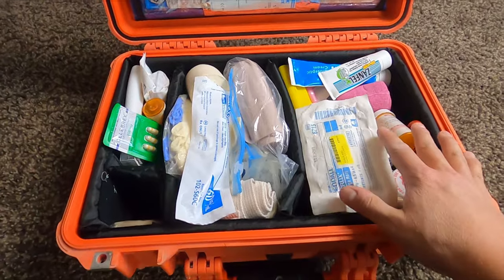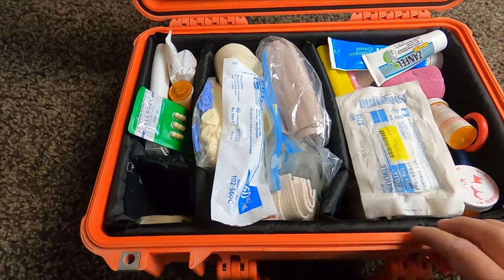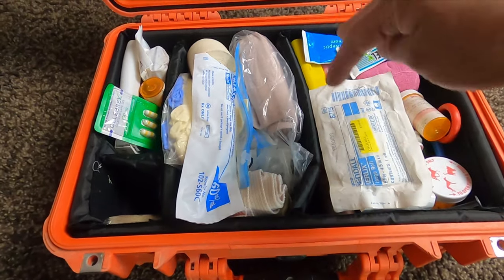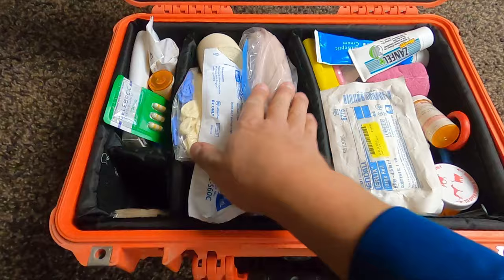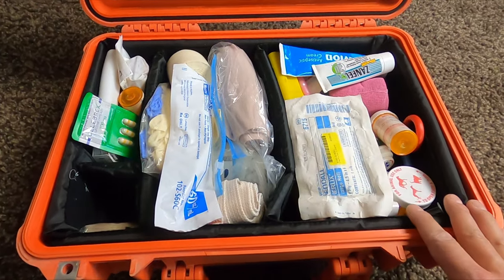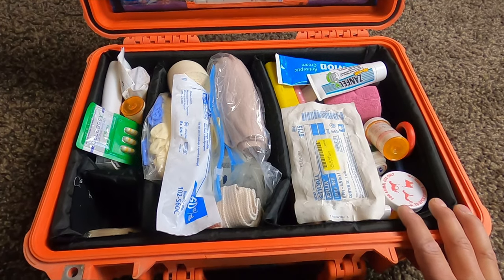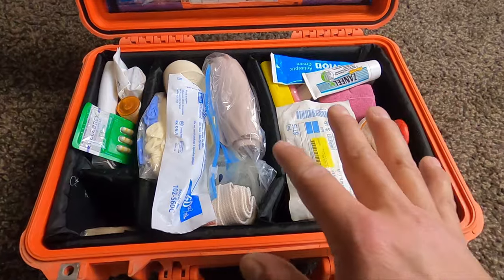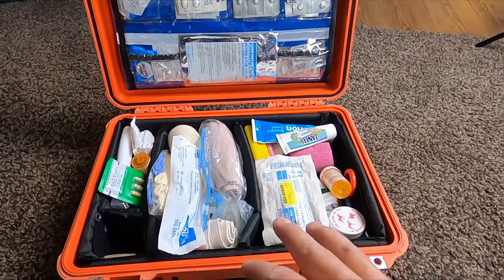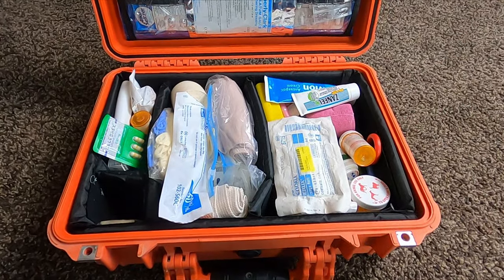In here, you've got kind of your traditional separator pads like you would see in a camera case. You can plug and play and make them whatever size you want. We've got it all kind of dialed out here. There's actually a lot of gear missing out of this currently because we pulled some out to do a little separate mini first aid kit we took on a different trip. However, I feel like this gives you a good idea about how much stuff you can get in here. You can really organize it to a T and keep it very, very dialed.